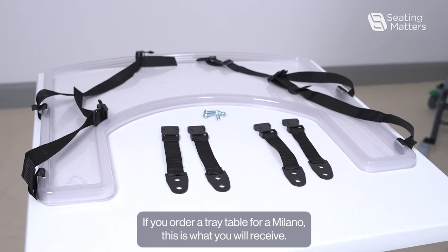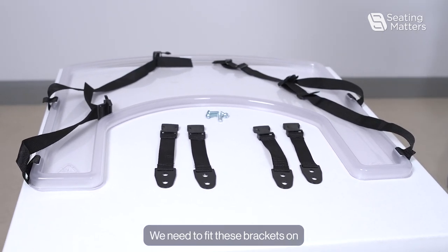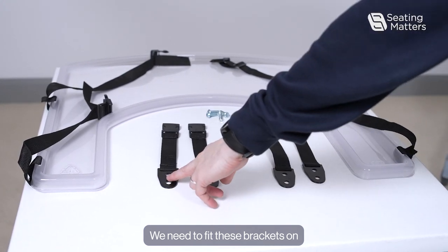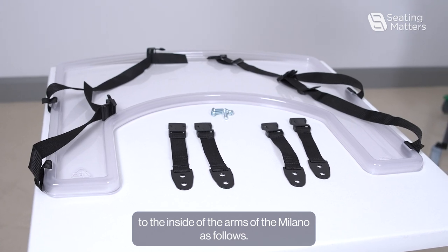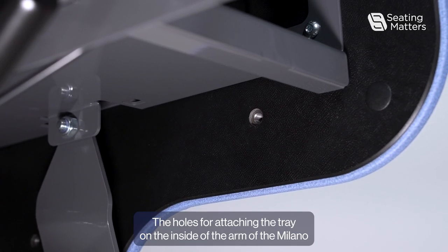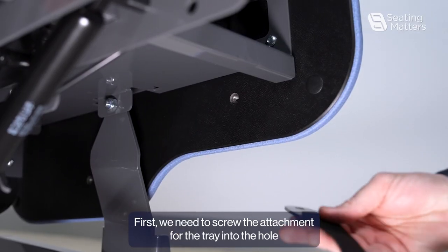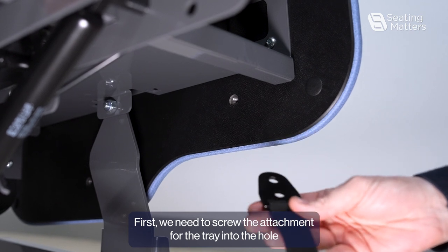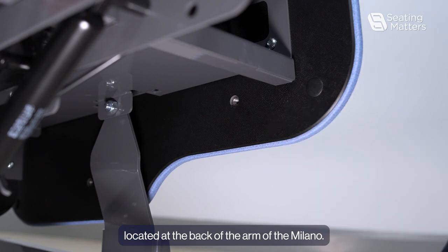If you order a tray table for a Milano, this is what you will receive. We need to fit these brackets onto the inside of the arms of the Milano. The holes for attaching the tray on the inside of the arm are located at the back of the arm. First, we need to screw the attachment for the tray into the hole located at the back of the arm of the Milano.